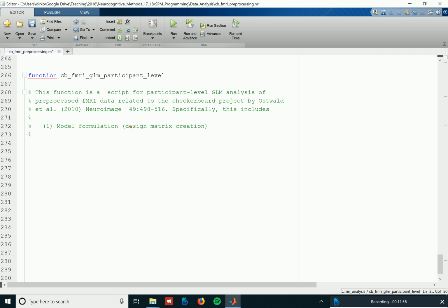So the big thing that you see if you use SPM for fMRI GLM analysis is that it's all focused on the design matrix. The details of how the covariance structure is actually created are not that apparent from the way you interact with SPM, but it is fairly specific. Because the whole thing uses a restricted maximum likelihood estimation approach, it uses a covariance component approach, and as I said earlier, you find that in the paper with Ludger from 2017.